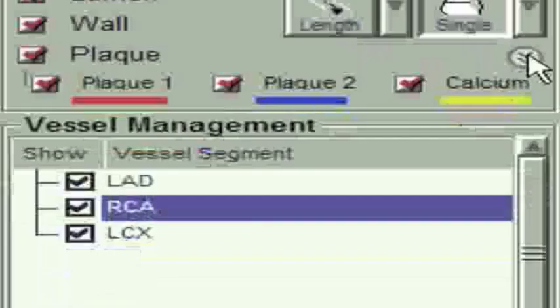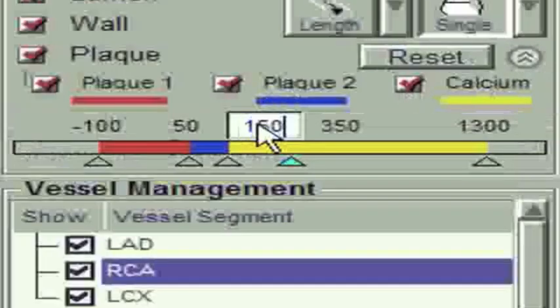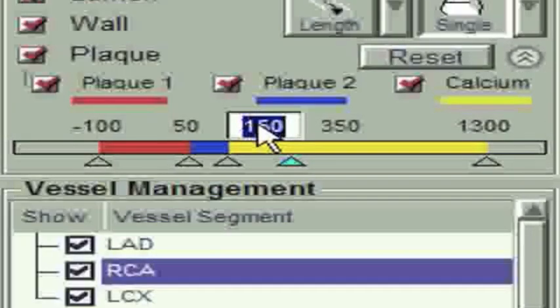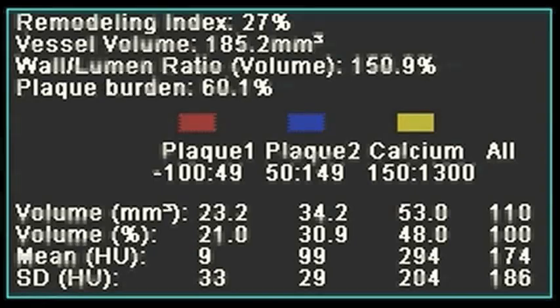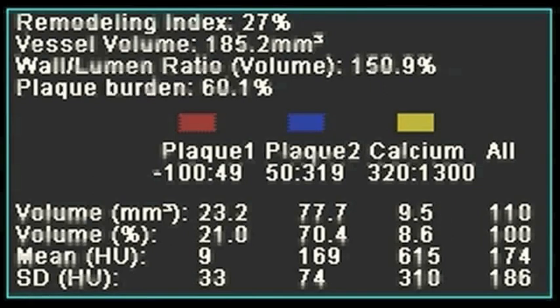In step three, we simply go to the plaque tool settings and change the threshold for calcium to a higher threshold, ideally 320 HU. By increasing the threshold, we see the volume of calcium measured drops substantially so that now 9.5 cubic millimeters of calcium has been measured.